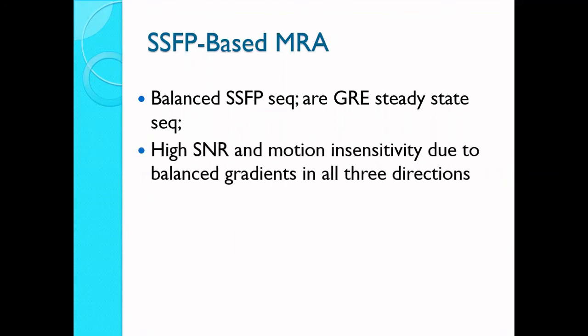The very important benefit of this particular SSFP is that it has a high SNR. High SNR is required because our main interest is in the angiography, in those particular arteries. How the supply is going there, whether there is any obstruction, any stenosis, obstruction, thrombosis, clots or anything.